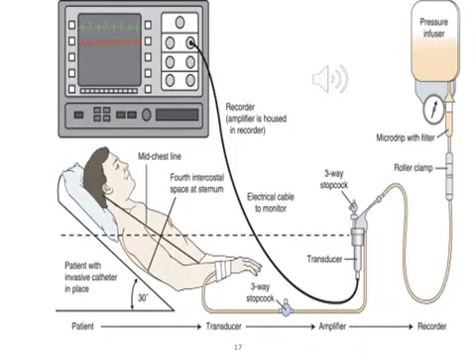Again, as you see here, from the patient, through the intravascular space, into the transducer. Transducers change the physiological signals into electrical ones. The amplifiers convert them into waves and digital numbers. Okay. As you can see here we have a stopcock. This is the monitor. This is the pressure fluid, and we also have the catheter as well.